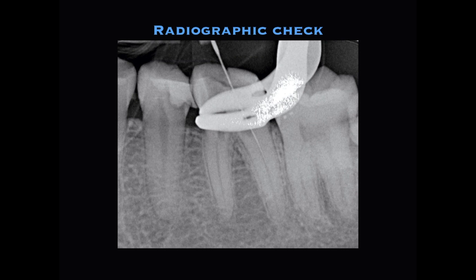I've found the canal. The next thing I want to do is take a radiograph. You can visually see in this radiograph that the file is in the distal canal. The reason for taking a radiograph is to confirm it's a canal and not a perforation — early identification and the size of a perforation really matters when it comes to perforation repair.